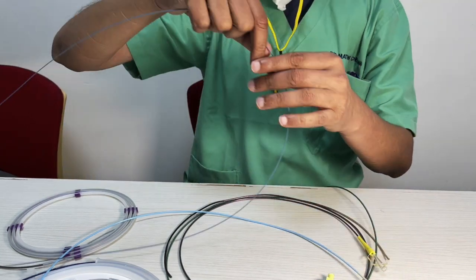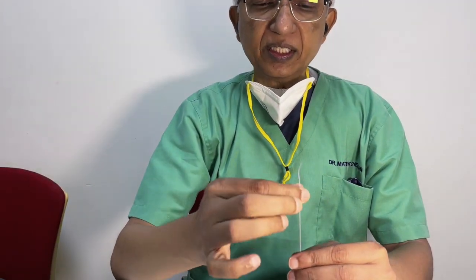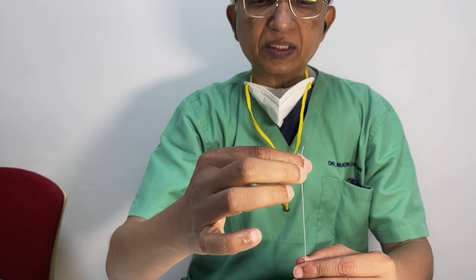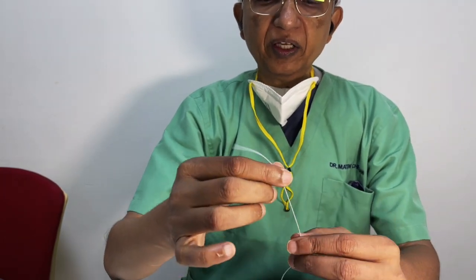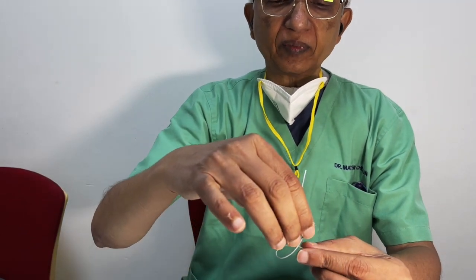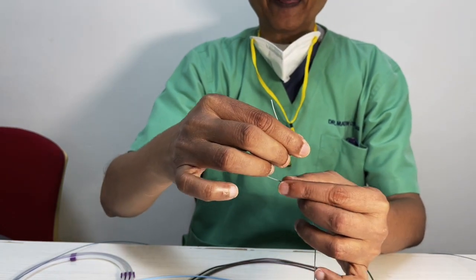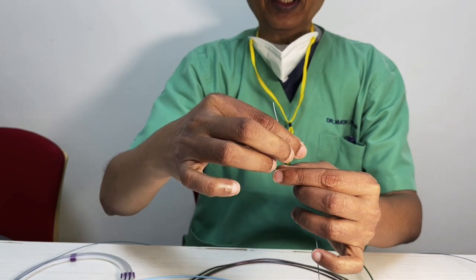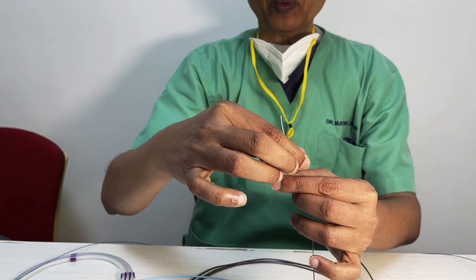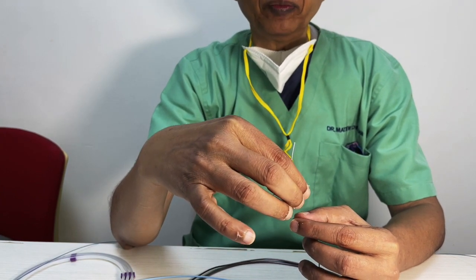If I have got a microcatheter here, I can just show what I'm talking about. See, so this is a microcatheter. Now just imagine this situation. I'm just showing this to you. Now, if this is straight, when I give a forward thrust, it's going to move up, right? It's pretty simple. It'll move up straight. Now, if I've got a loop like this, suppose this is a kind of loop they will develop in a large vessel. When I push here, the pressure will build up on the apex of the loop, and after a certain amount of pressure builds up, only then it moves forward. So this will result in a very rapid jerky movement.